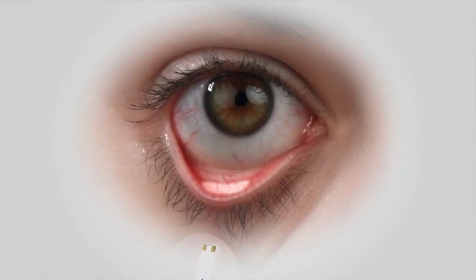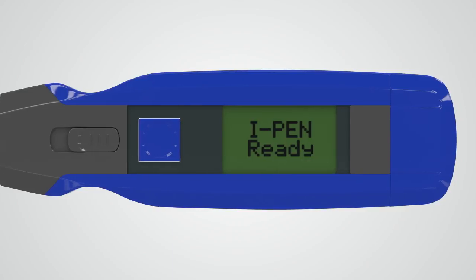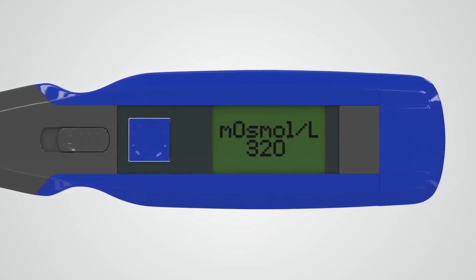When correctly placed, the tip of the single-use sensor should be depressing the surface slightly so both gold terminals on the tip of the sensor are in good contact with the conjunctiva. The iPen will emit an audible beep after taking 250 readings in several seconds and will display the results on the LCD screen.